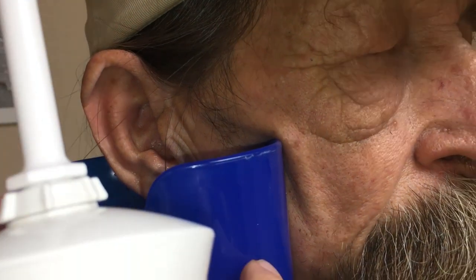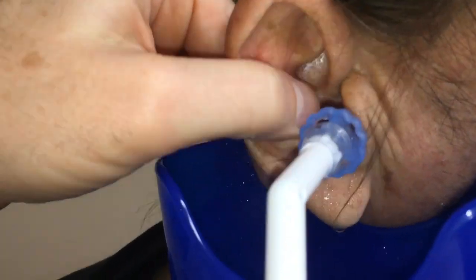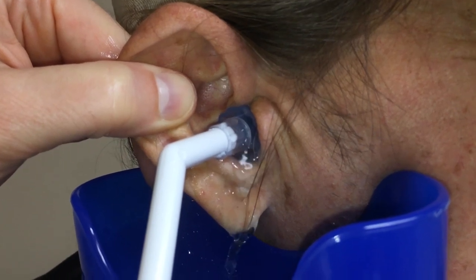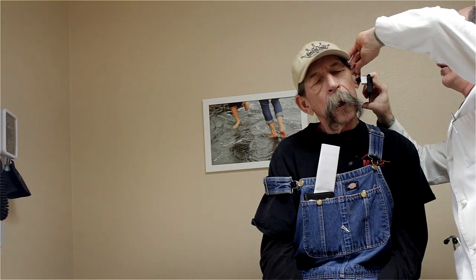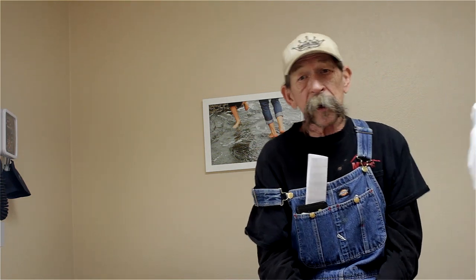I heard the tone change. So that I can get in with my hand here — there we go. Would you look at that? That is a perfect eardrum. It's still got some wax on it, but we're not getting the wax off the eardrum — it's a little irritated. That's why there's some redness right there where the bone really sticks out against it. But other than a little irritation, you're good. So I'll give you a choice: do you want me to try to get it out in one piece with the curette, or do you want me to go in with the water? Oh, the blaster seemed to work good — he wants the blaster.